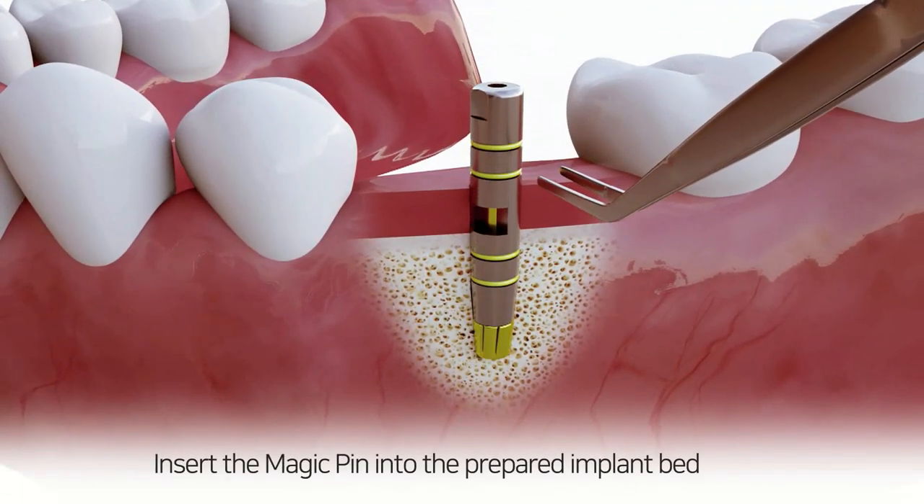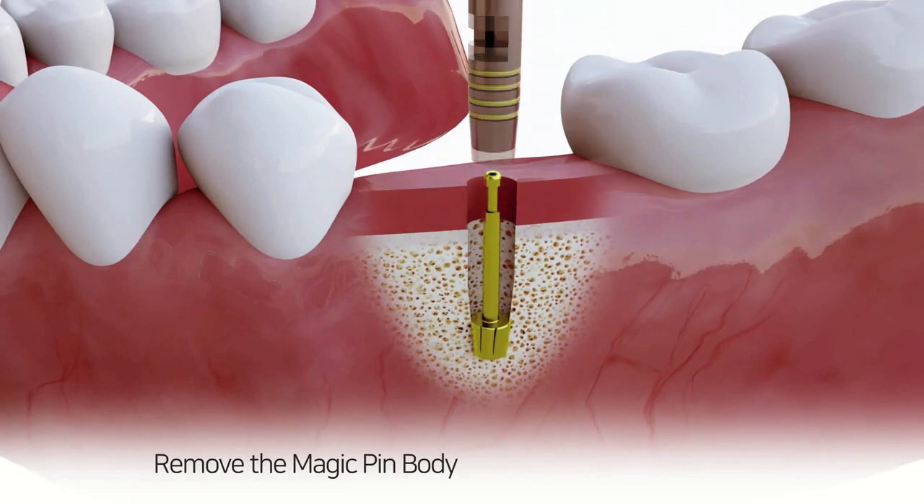Insert the magic pin into the prepared implant bed, then remove the magic pin body.